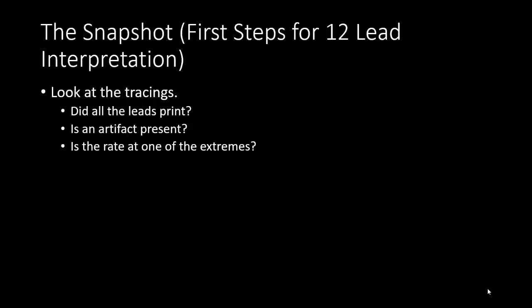And also, we need to identify is there artifact present, because again, it's very important that you make sure that you are not moving around. You need to make sure that your patient is still whenever you're trying to print off your 12 lead, because your 12 lead EKG is actually more sensitive when you're trying to get all of the leads. And really, it's pointless to print off a 12 lead ECG if you're not getting all of your leads, because you want to be able to tell all of the different areas that this will provide.